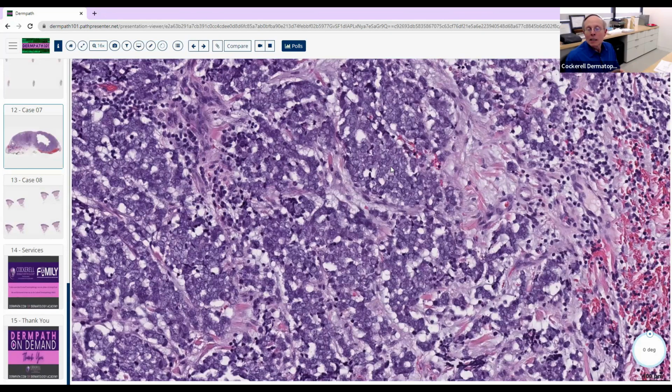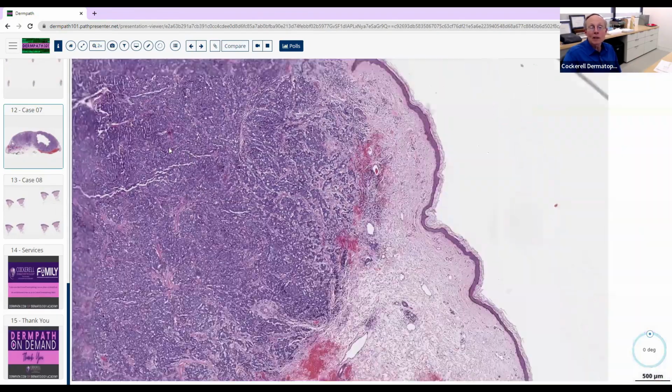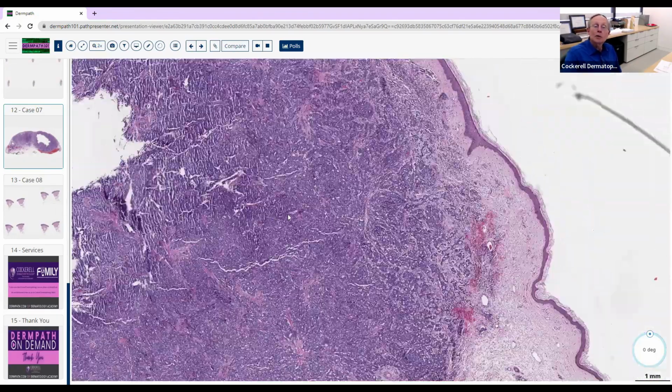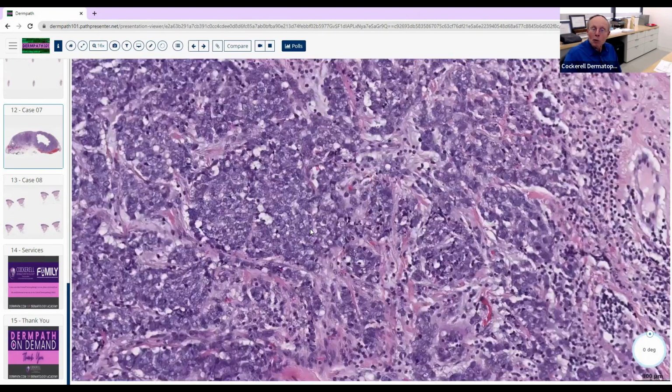Those tumors give you this blue cell morphology. Carcinoid tumor, blue cell morphology. Poorly differentiated anaplastic lymphoma is in the differential diagnosis here. So when we get one of these lesions, obviously we ask ourselves, what's the setting? Is it a child, is it an adult? And then probably the one other thing that the board might ask you if they showed you this and said this lesion was positive for cytokeratin 20, Merkel cell or neuroendocrine carcinoma, what is one potential etiology of this tumor?